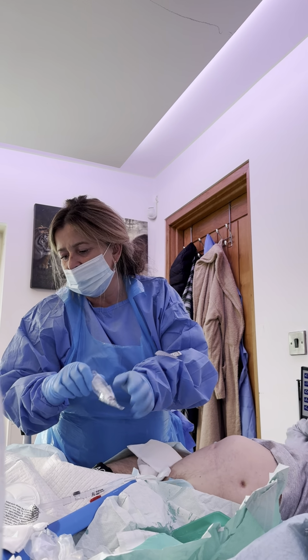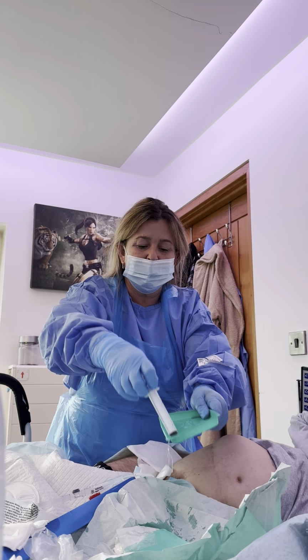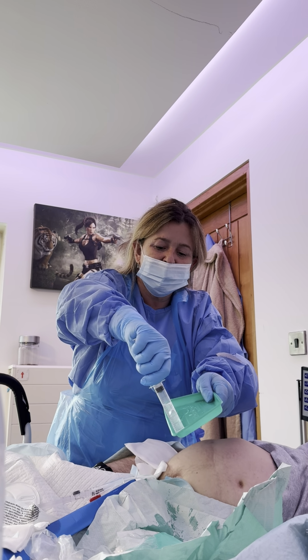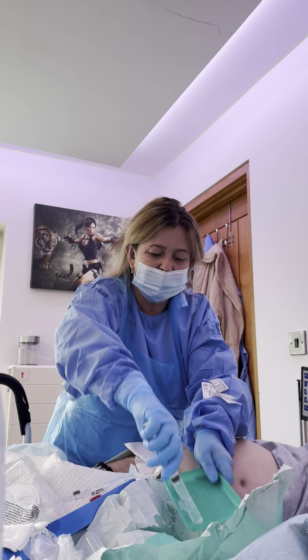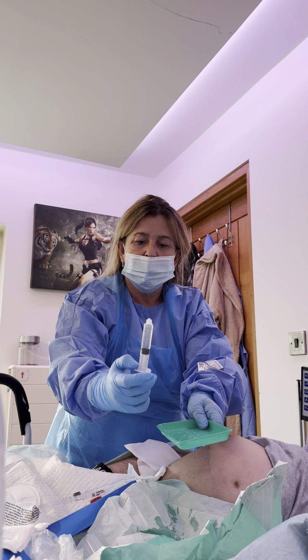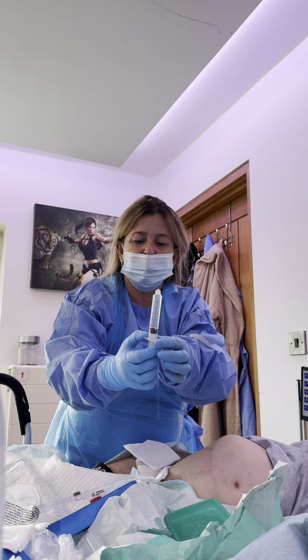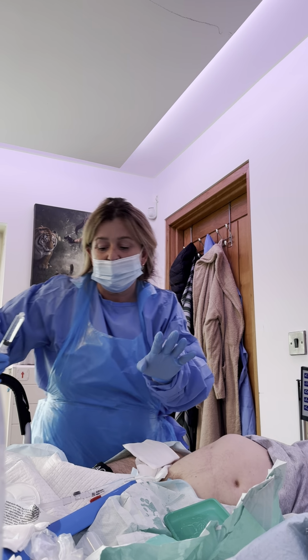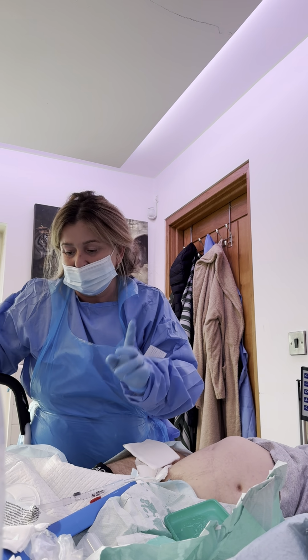So I've got a syringe. If you had to do it manually, you just make sure there's 10 mils in there, which there isn't because I didn't put everything in. Tap, tap. So there's your 10 mils. I'm going to put another mil in this in a minute, but I won't do it on camera because I haven't got time for this. He's had no lunch, so I'm going to get on with it.